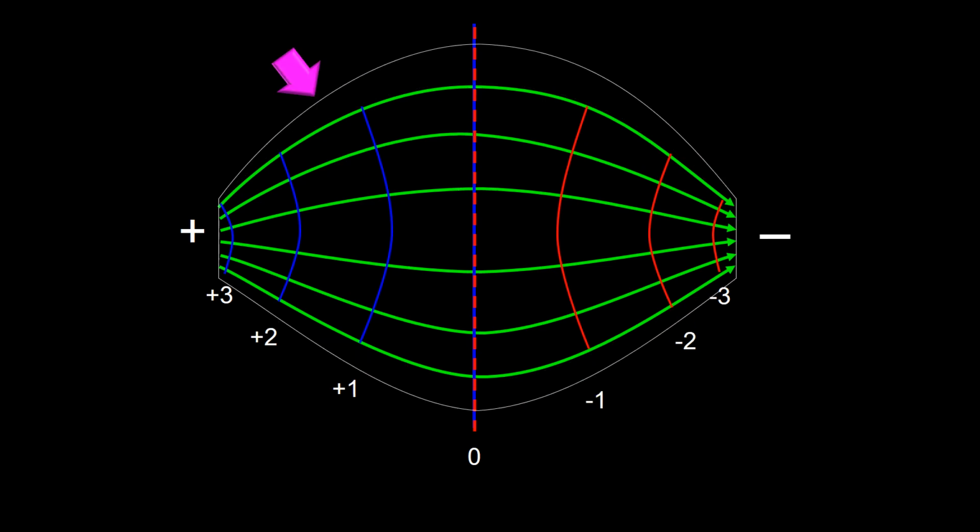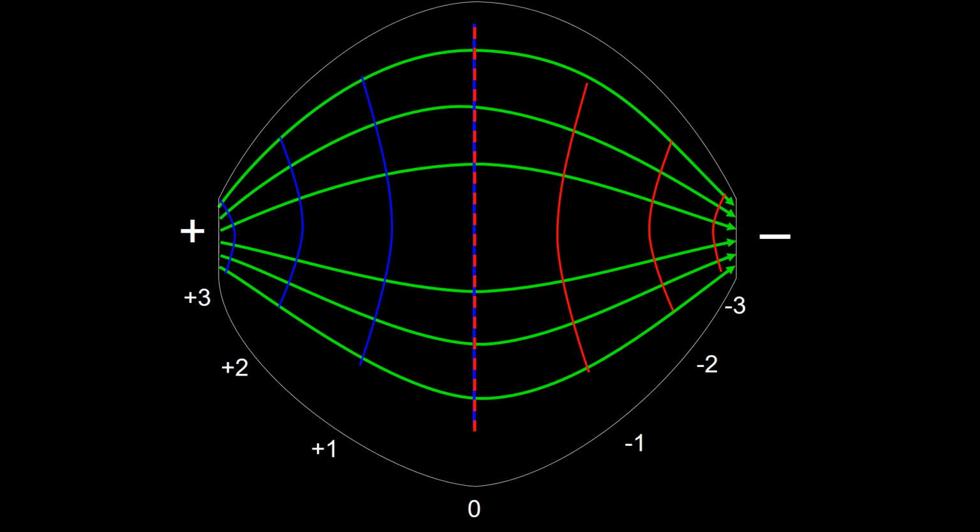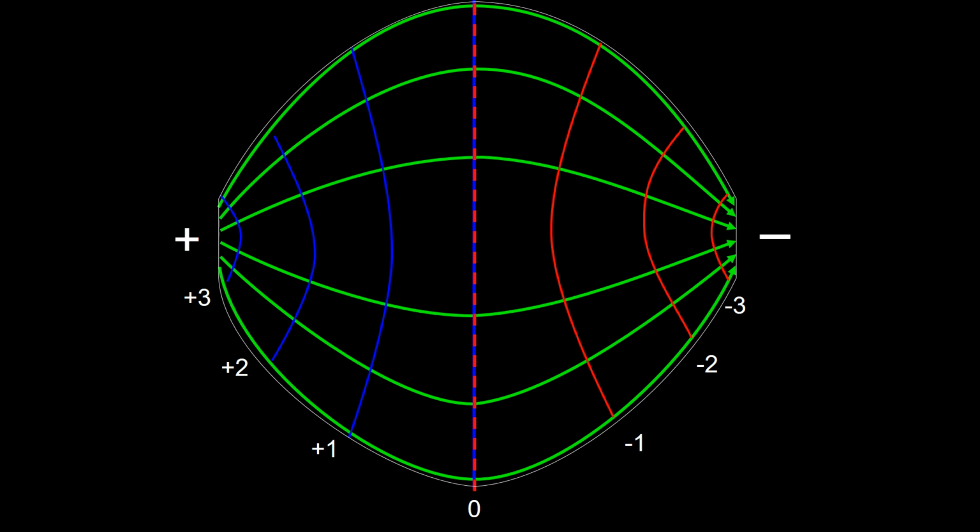Were we to increase the conductor even further, the current lines will adapt and the isopotential lines will change with them. And once again, were we to change the size of the conductors once more, the current lines as well as the isopotential lines will adjust to it. Notice that the midline isopotential line, the red and blue one, remains straight. And also consider that we have attempted to represent fictitious one or two-dimensional conductors.